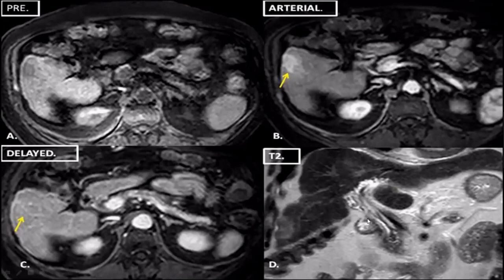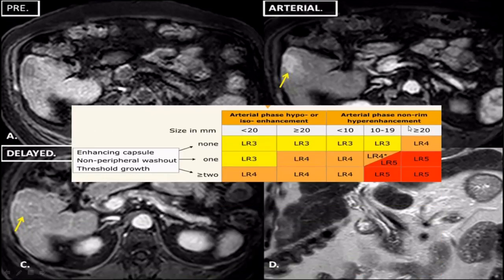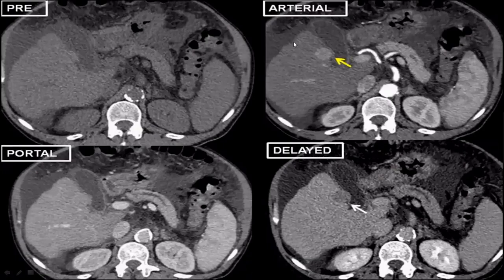In another similar lesion with arterial phase hyperenhancement, there is no washout in delayed phase. For washout, the lesion must become hypointense relative to surrounding parenchyma; otherwise it cannot be labeled as washout. On T2 weighted image there is some hyperintensity. According to the table, the lesion is approximately 2 cm, shows arterial phase hyperenhancement, but none of the three additional features — so it falls into LR-4.